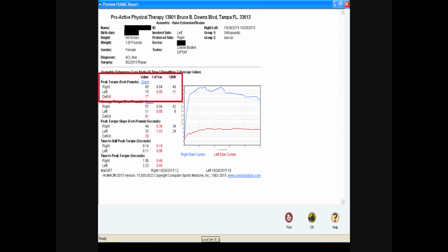Now, the third line over shows you what the torque compares to body weight. And John, he's going to discuss isokinetic testing, that peak torque quad should be 100% body weight. If you remember back to episode 5, the force velocity curve, remember, isometrically, you can produce more torque than you can concentrically. So 100% body weight is a good measurement to use to compare here. And again, if you're testing the hamstrings, you're looking at that traditional 60 to 80% ratio. And again, this is where the American units of pounds to foot-pounds comes in handy, because it's 1 foot-pound of torque to 1 pound of body weight.